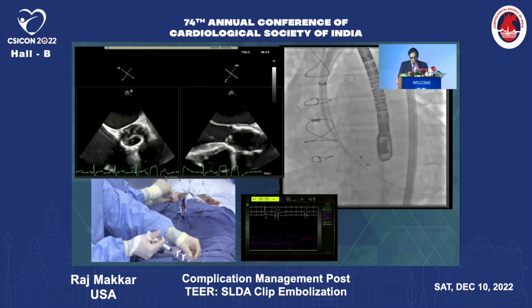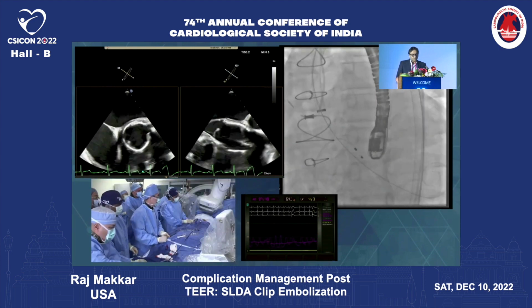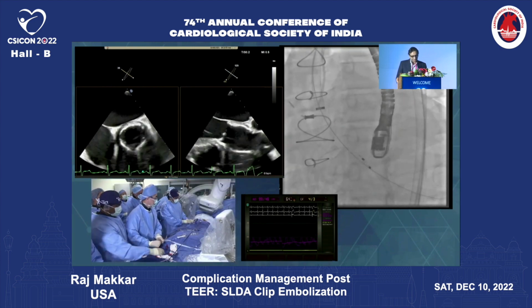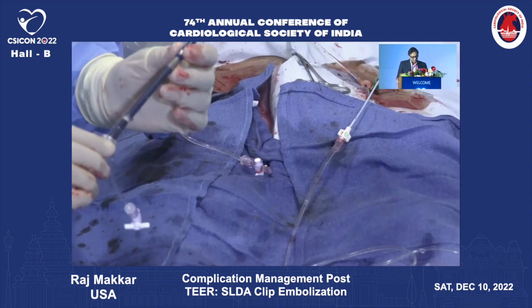With this system, they say 2 millimeters above the STJ. This patient had an aortic graft, and we wanted to make sure that we are flush below the anastomosis.